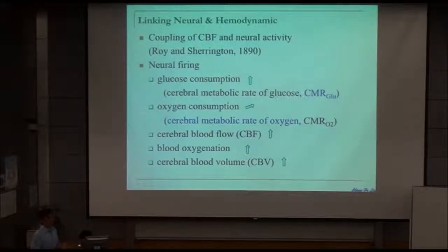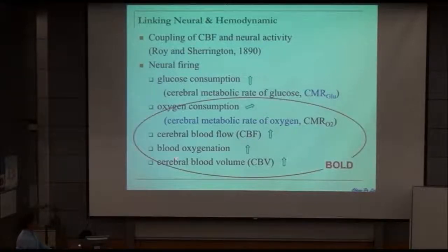That is very important. There is a paper published in 2002 in Nature talking about such phenomena. So MRI can measure all of these changes, and they combine together to produce the BOLD signal. That's what we talk about.